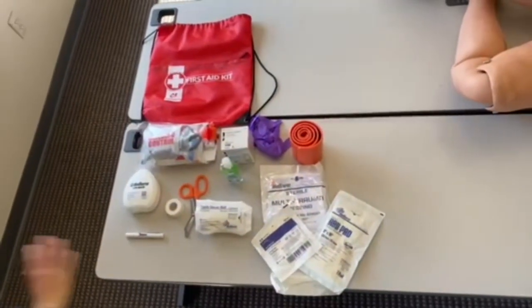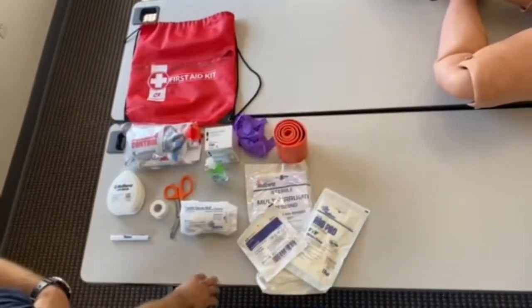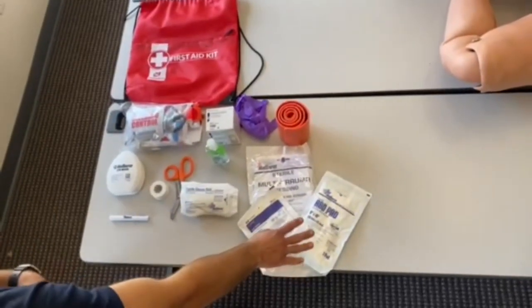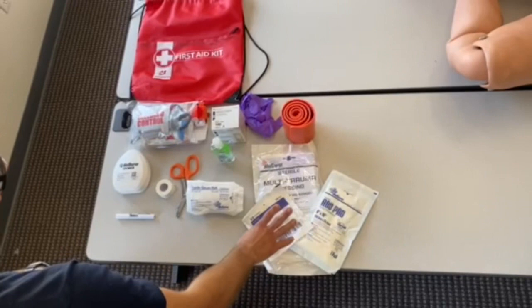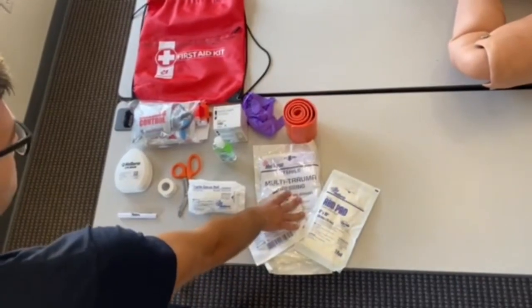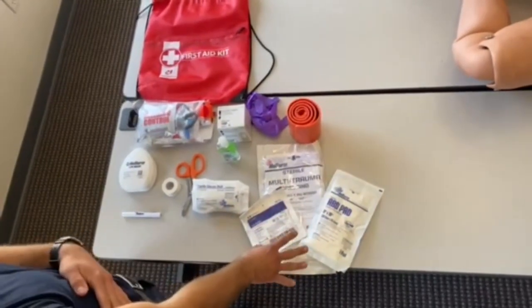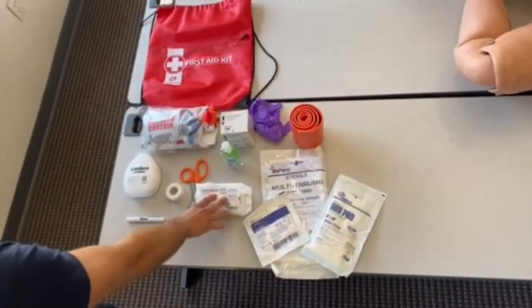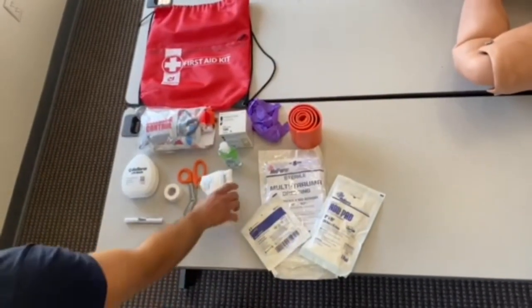Once you find your first aid bag, these are some of the key items you'll find. We have various types of bandages: ABD pads, 4x4s, and a multi-trauma dressing. They're all essentially the same thing — just large bandages. You also have a gauze roll, which you can use to apply the dressings.